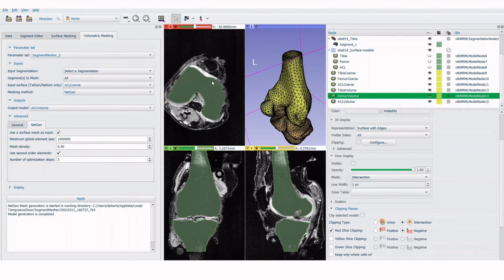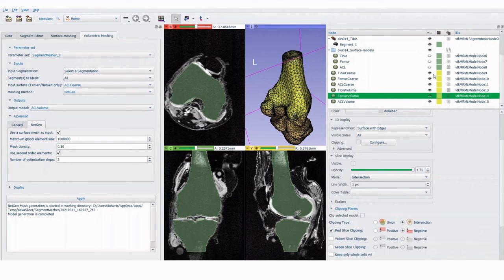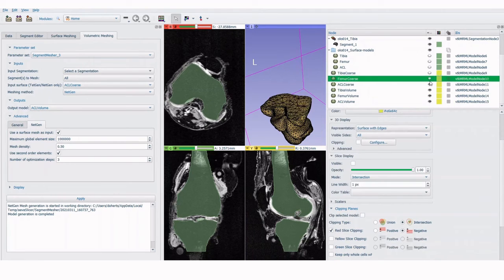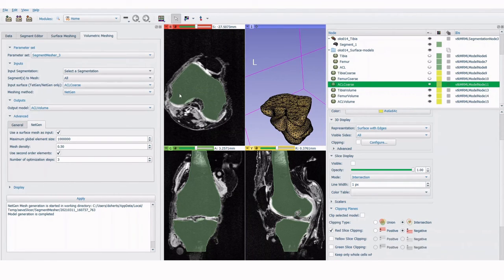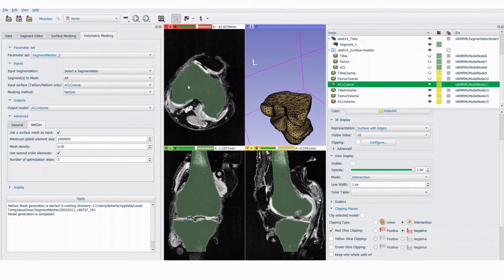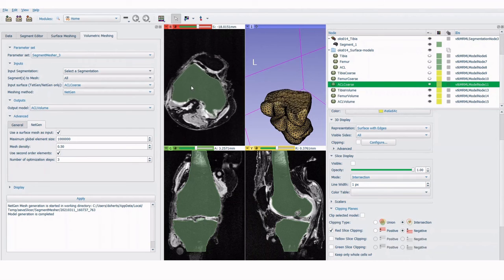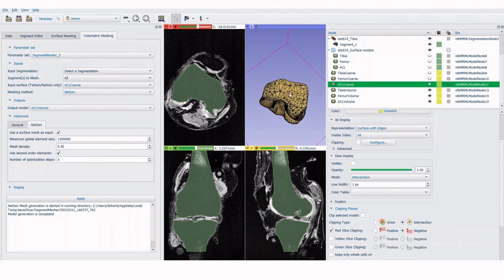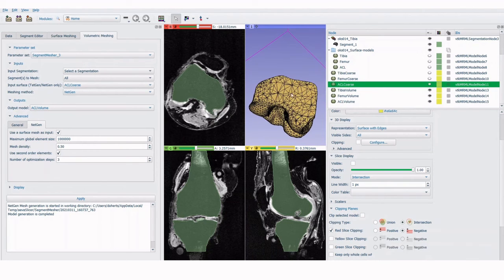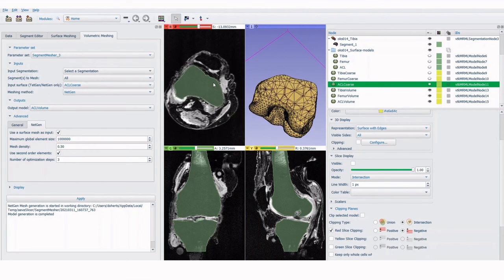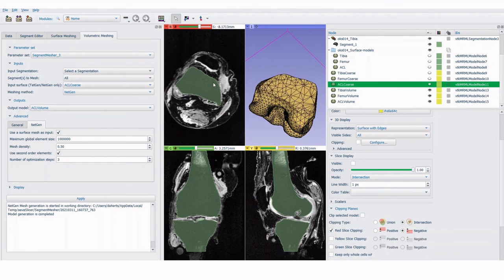Using a clipping plane can be a helpful way to visualize the result of the volume meshing tool. You can then save the volume mesh as a VTK file by navigating to File and then Save to store your newly created model output.